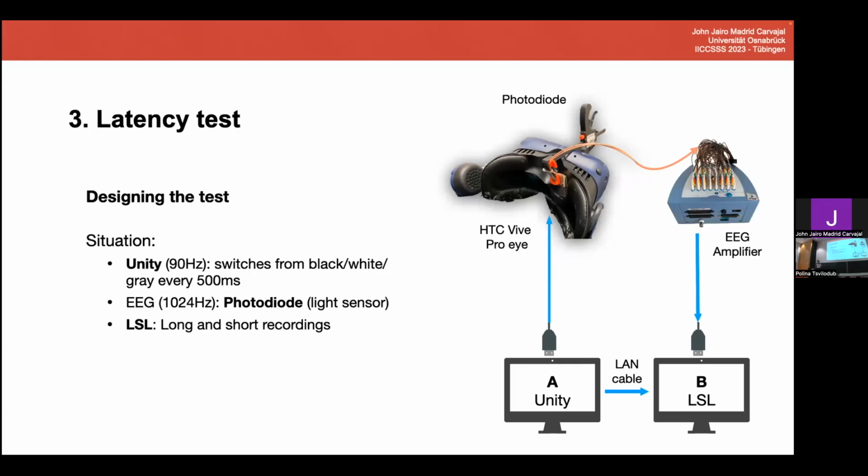The only reason why we used 2 computers was to decrease the complexity, because you have a very, very heavy Unity game at the end, right? That is running on a specific computer and needs all the resources to keep the sampling rate. If apart from running your game you also collect the data from that computer, then the computer just gets too many tasks, so to say. That's why we use 2 different computers, one to run the Unity environment, and the other one to collect the data.